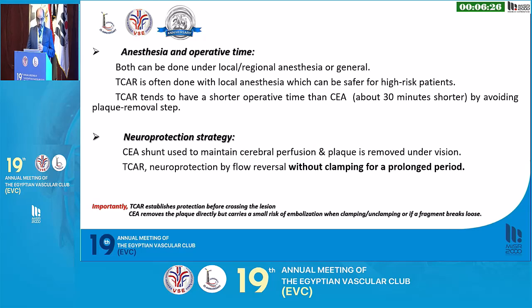About the neuroprotection, in carotid endarterectomy a shunt is used to maintain the cerebral perfusion, instead of the TCAR, where neuroprotection is provided by the flow reversal system without clamping for a prolonged time.